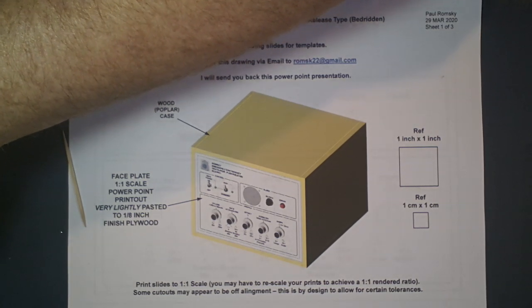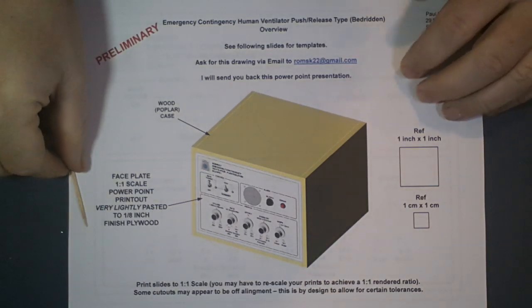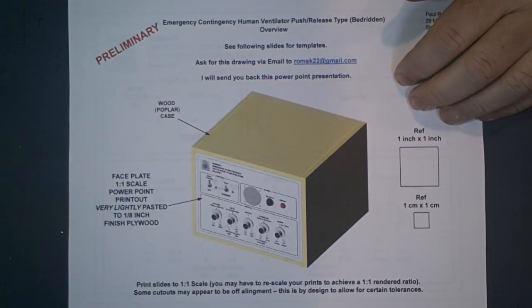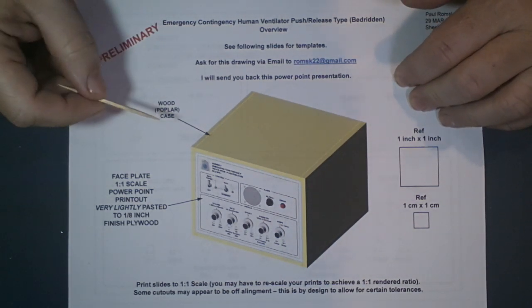Reduce the harsh lighting, but you can print PowerPoint one-to-one drawings and paste it on plywood like that, and it makes a nice front panel if you don't have plastic or metal or anything like that. As you can see, you can get professional stenciling, and I have a power supply that I made, so I'm just using the same concept.